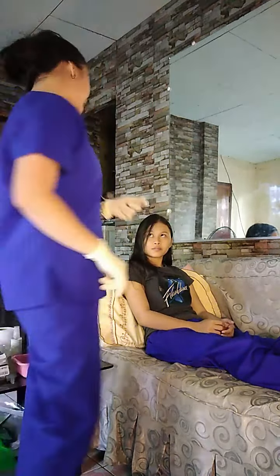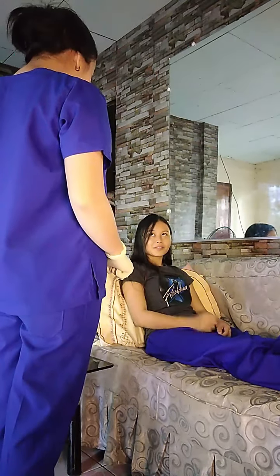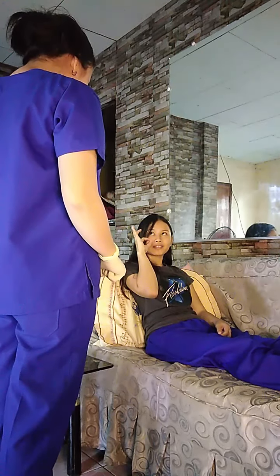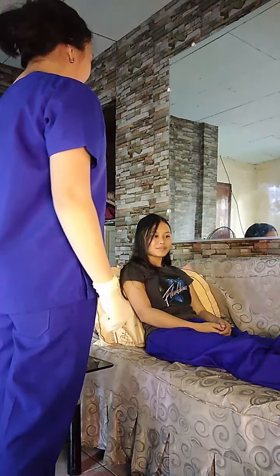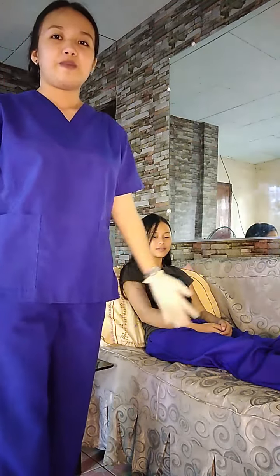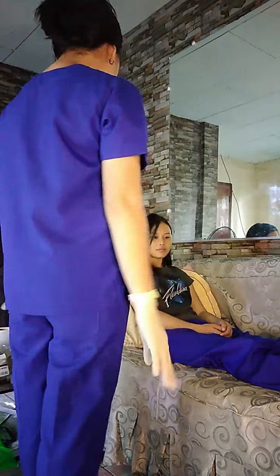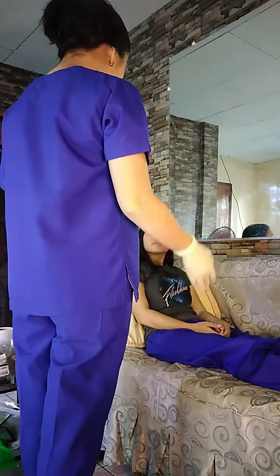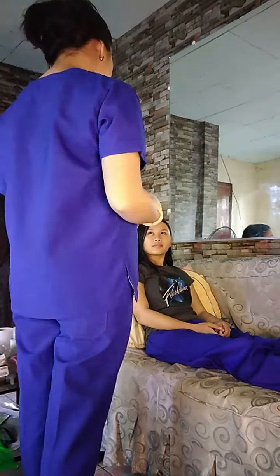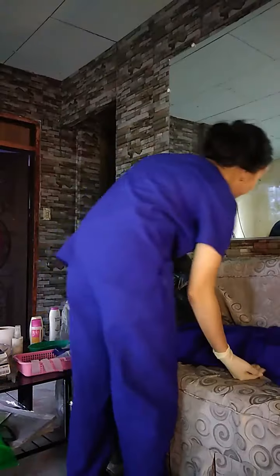Okay, so after wearing my clean gloves, I will now position the patient to a high Fowler's or semi-Fowler's position. So, ma'am, kaya niyo po bang i-tolerate yung makaupo po kayo para po maging maayos yung ating insertion? Yes po. Sige po ma'am. Ipoposition ko po kayo ngayon ma'am.